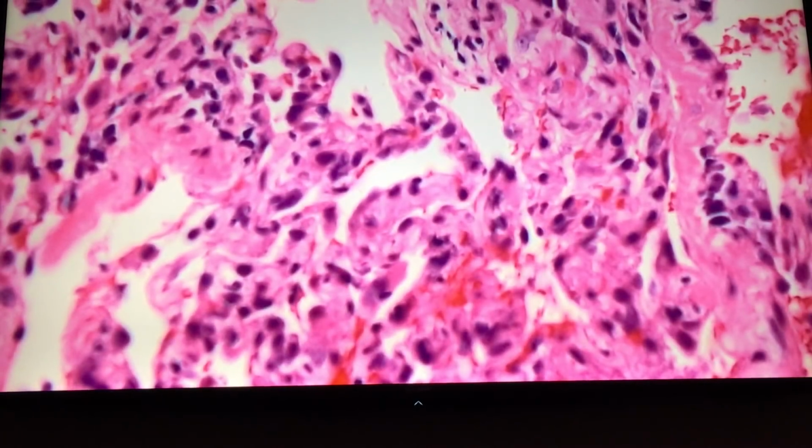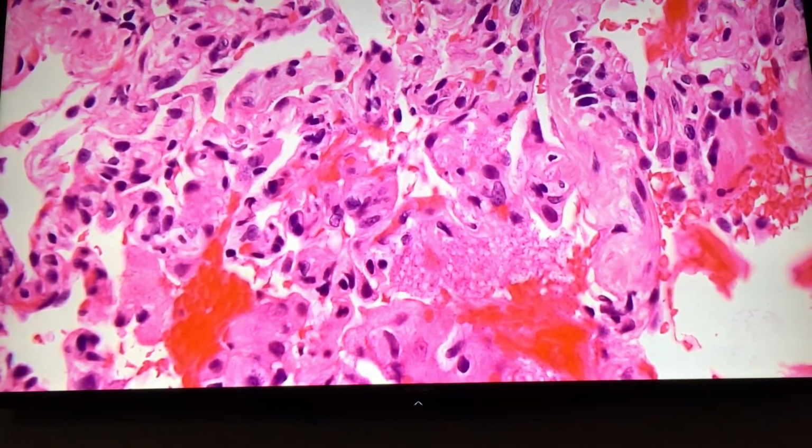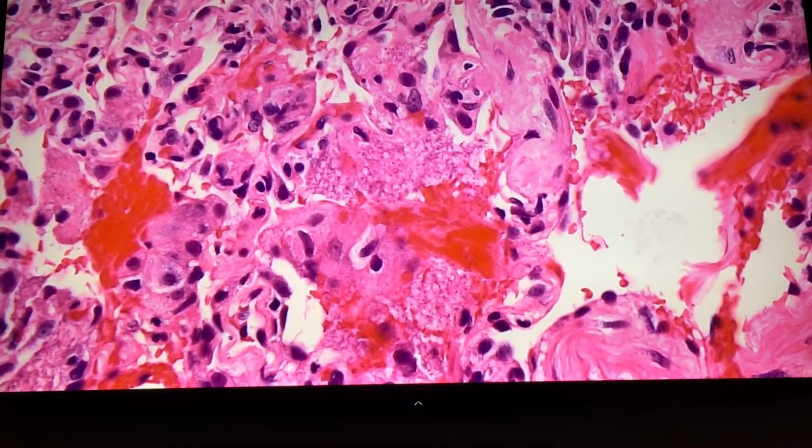Now just burn that image into your brain, because this can be a game changer in terms of the patient's diagnosis. This can lead to serologic testing, and you know how it can be. It can lead to an HIV/AIDS diagnosis. You can find out the patient is severely immunosuppressed. So this can be a very, very consequential diagnosis. But look at what's happening.